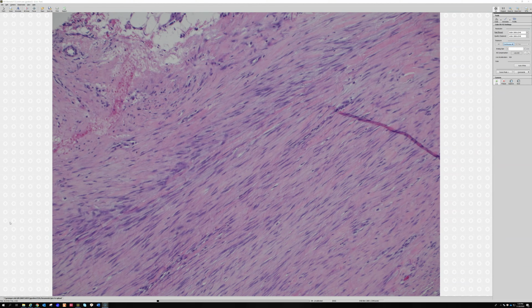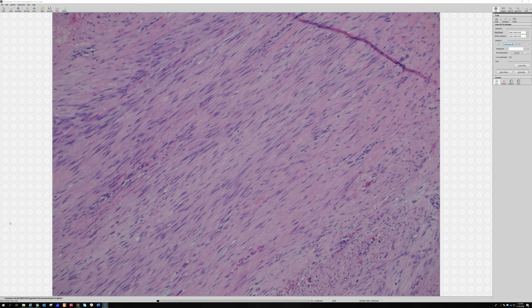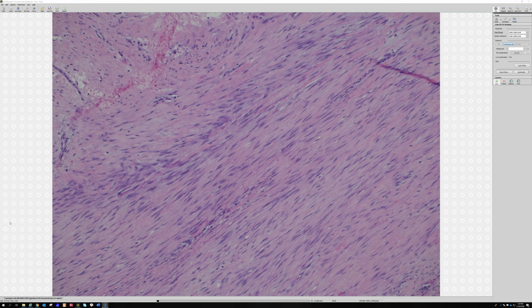The other thing, these tumors are driven by beta-catenin. So nuclear beta-catenin is what the classic test question answer is. And in real life, I find beta-catenin can be really challenging to interpret because it often has a lot of cytoplasmic staining, which is totally non-specific. The only thing that matters is seeing the nuclear stain. And sometimes the cytoplasm has so much stain, it's hard to tell if the nucleus is staining.